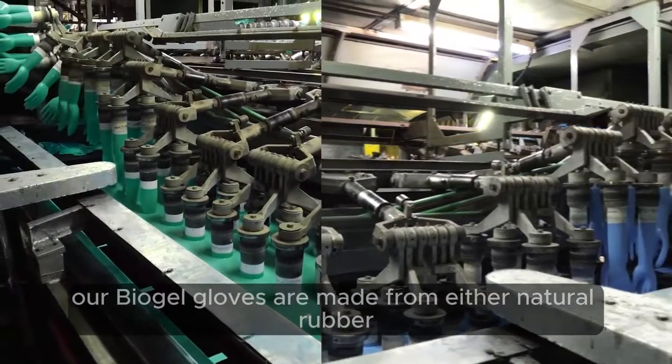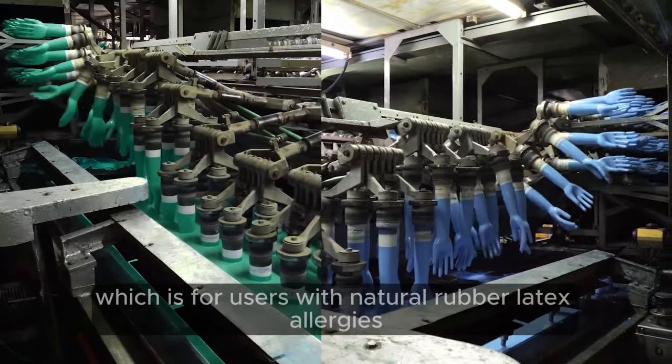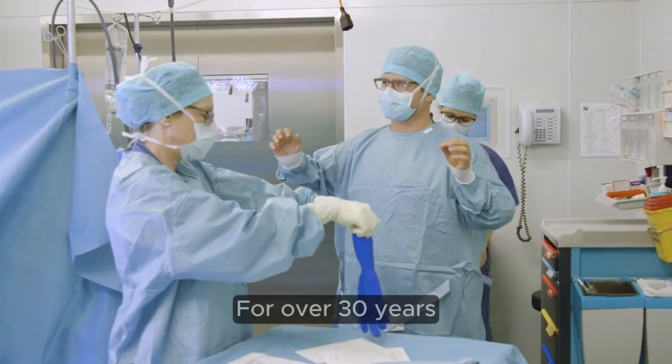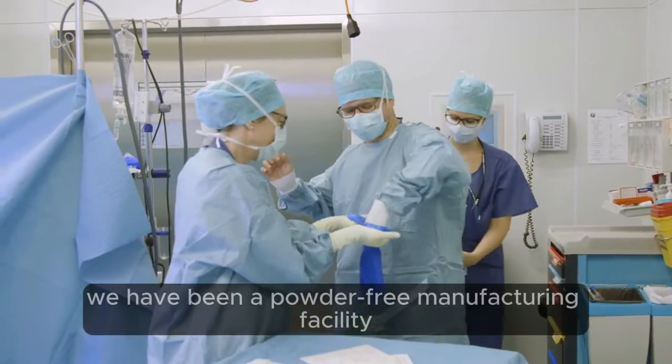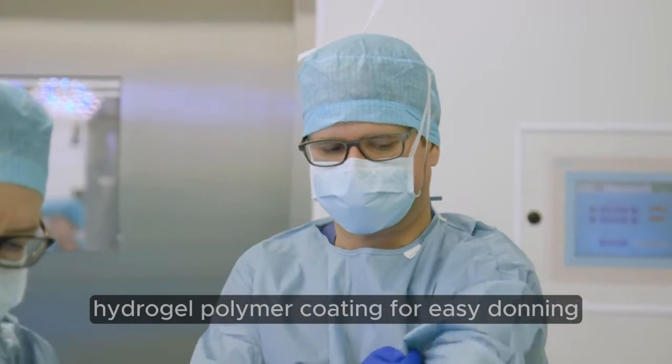Our Biogel gloves are made from either natural rubber latex or synthetic rubber, which is for users with natural rubber latex allergies. For over 30 years, we have been a powder-free manufacturing facility, and most of our gloves use a thin layer hydrogel polymer coating for easy donning.